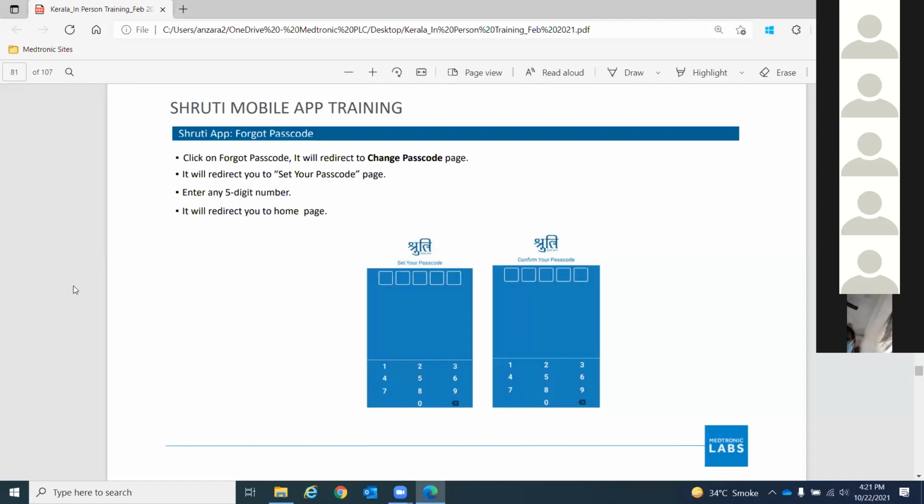So if you are going for a camp, you need to charge the device again, so that both the LED battery and mobile battery get charged. The mobile battery will remain the same, but if you are not using the device for 3 to 4 days, that LED battery will drain out. Okay, okay.